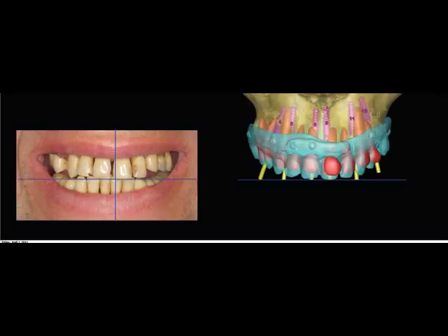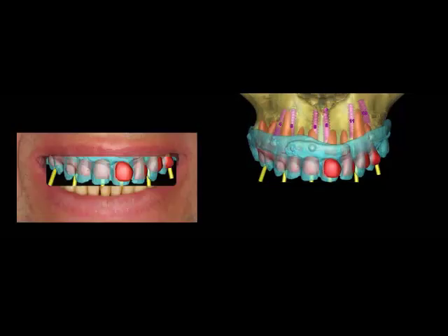So what we've done is we did our radiographic template, we scanned it in, there's our plan. And what you see here in red is the patient's existing, and in teal is the patient's new prosthesis, what we're planning on doing and how we planned everything together. So we've addressed these concerns such as tooth length, and before we ever started this whole process, we also adjusted his lower teeth to help make space for the proper smile line. So now we can superimpose that new smile into the patient's existing smile.